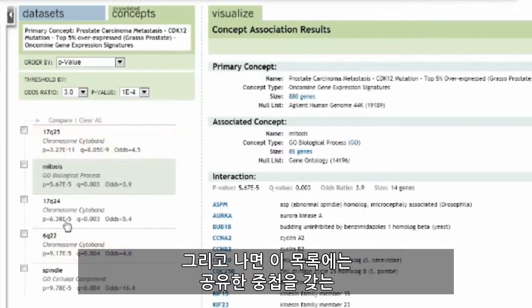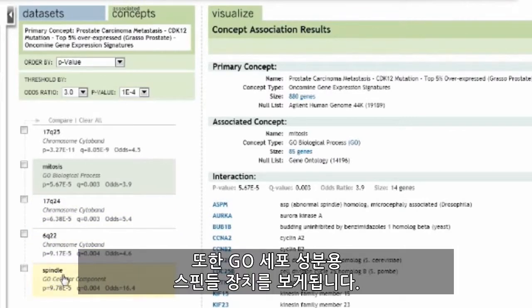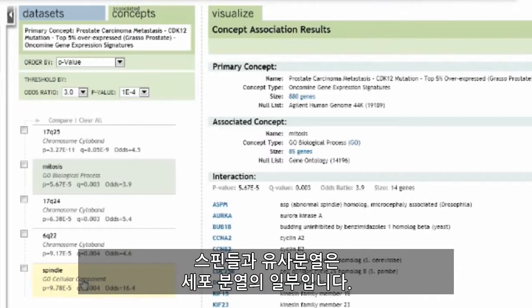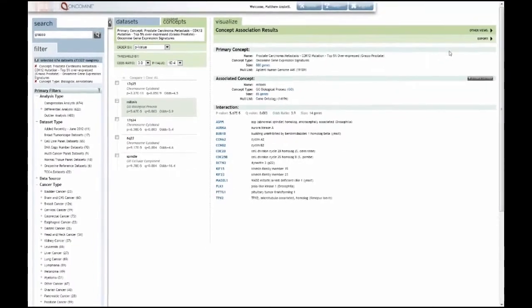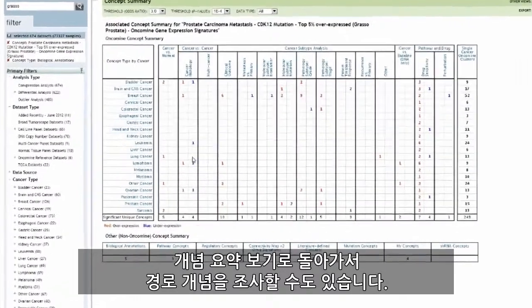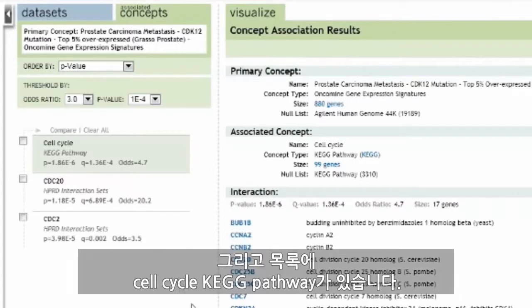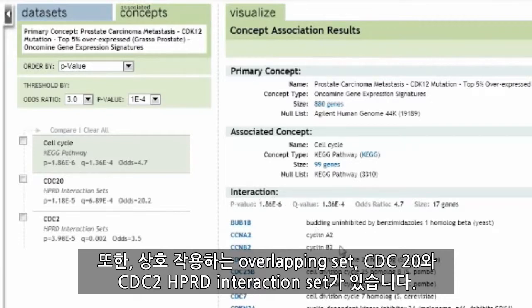Within this list, we also see chromosome cytobands 17Q24 and 6Q22 as having shared overlap. We also see spindle apparatus as a GO cellular component, with spindle and mitosis being part of cell division. Returning to our concept summary view, we can investigate pathway concepts — there are three results, including the cell cycle KEGG pathway, and CDC20 and CDC2 as two HPRD interaction sets.